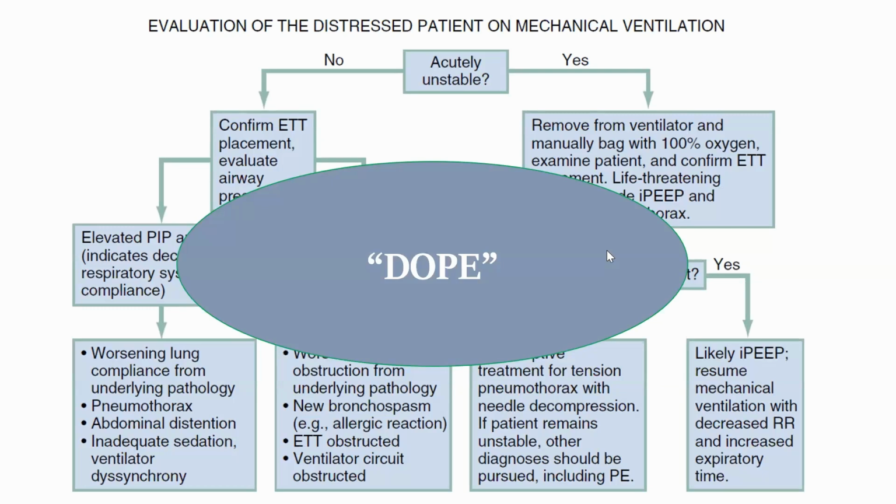If you, for example, decrease the rate, the auto PEEP of 5 may decrease to 2, for example. And if you set the PEEP to 8, for example, it will be easier for the patient to trigger a breath. If the total PEEP is 10, the patient has to trigger a breath down from the level of 10 if the patient develops auto PEEP.